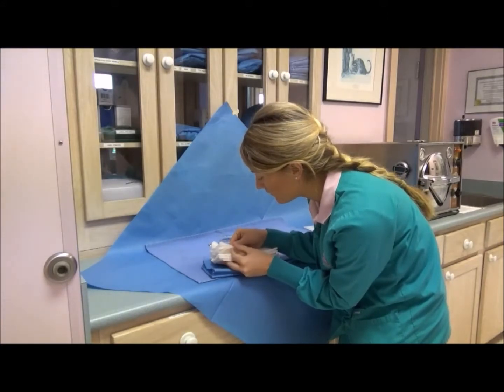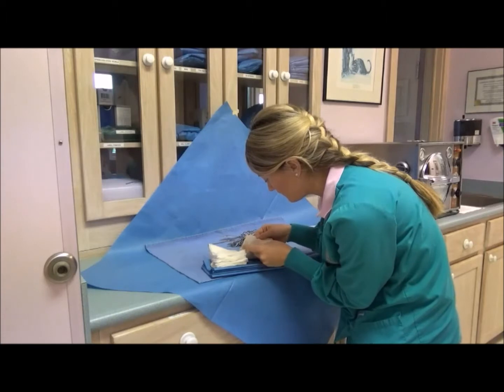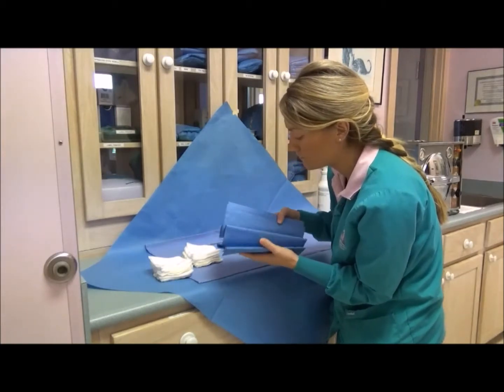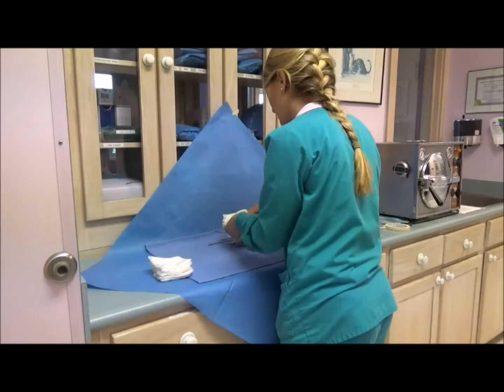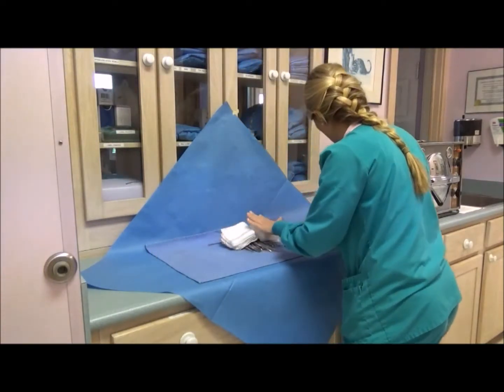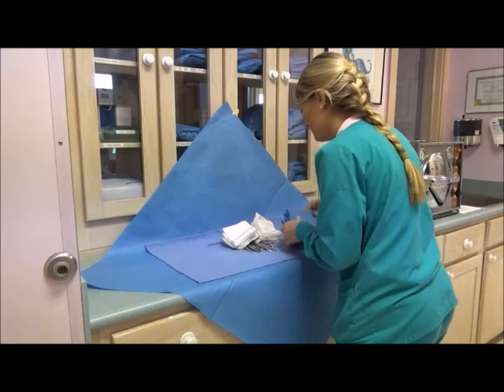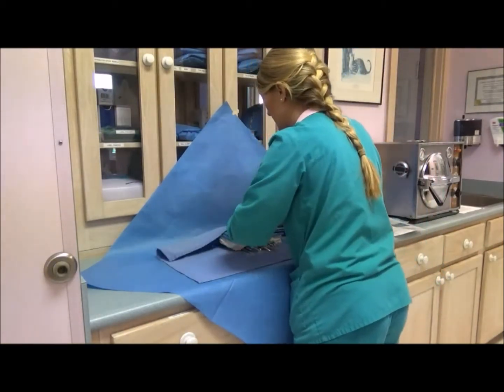2, 4, 6, 8, 10. And then we have our disposable surgical drape, and we fold it accordion style, of course. So place the sponges just right on top of the tool, just as it shows in our template. I'm going to put my steam indicator strip right in the middle there. And now I'm good to go ahead and fold the towel.